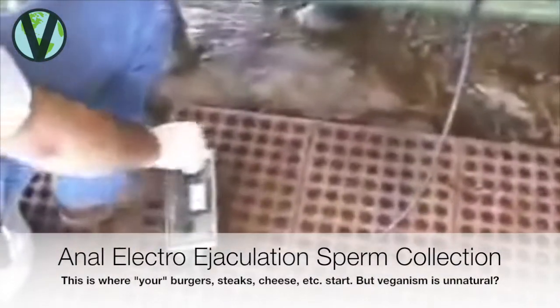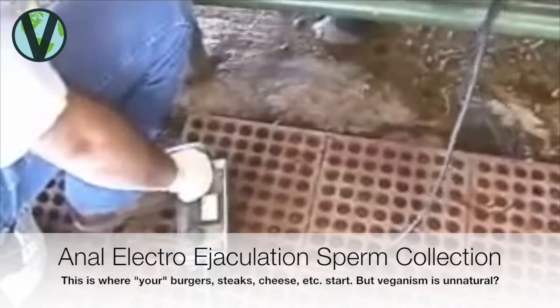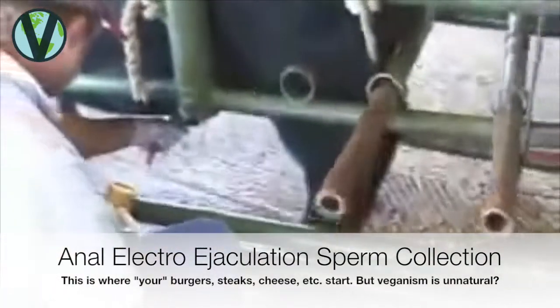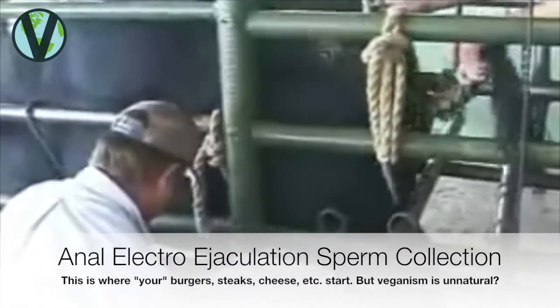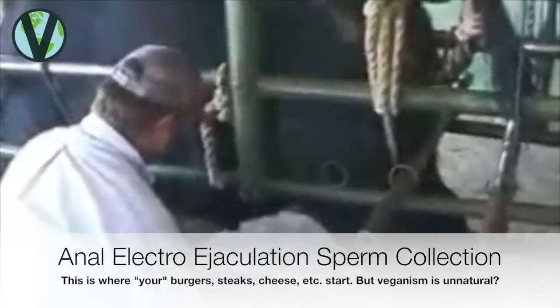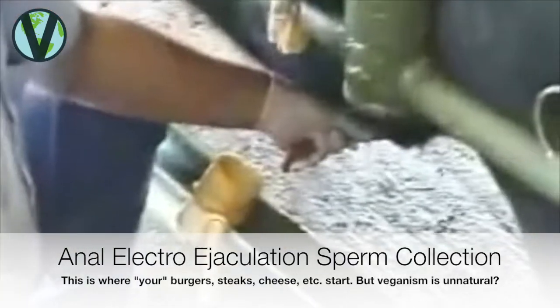and we do this in a pulsation sort of method, in which we will stimulate for 2 to 3 seconds, relax 2 or 3 seconds, and continue to repeat this process until the bull starts to actually ejaculate. So here a stimulus is being provided to the bull, stimulating those muscles, and then we would relax that stimulation to allow some of the semen to start to be collected.